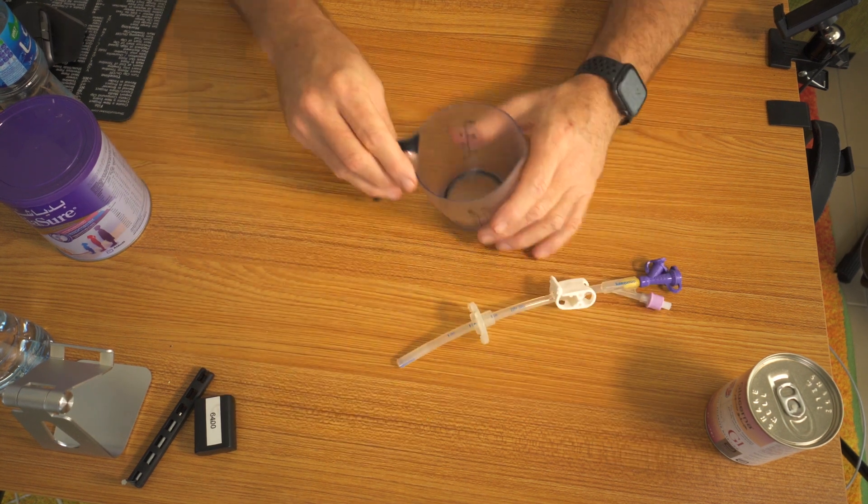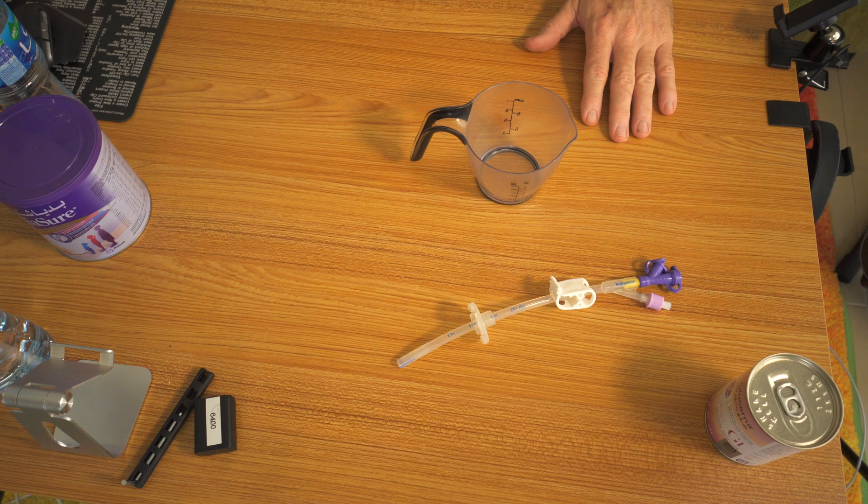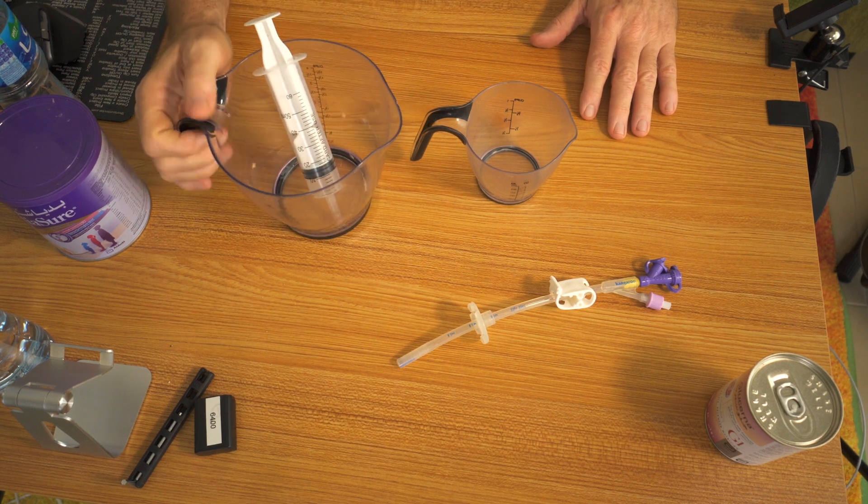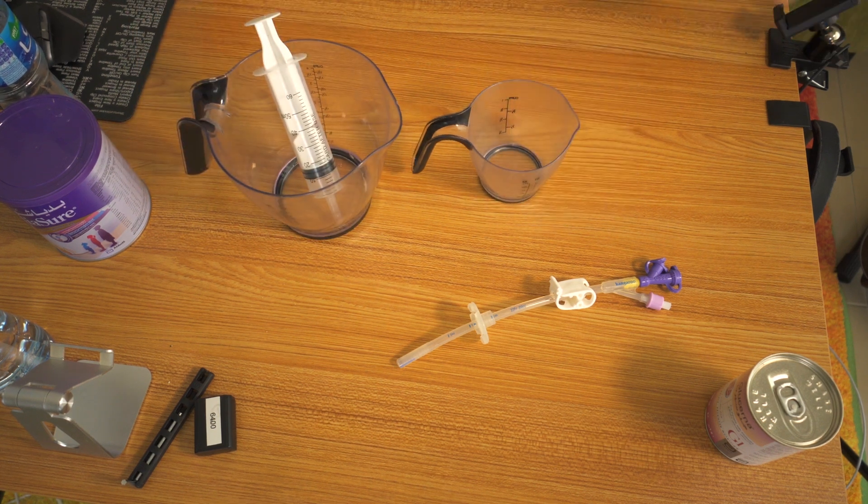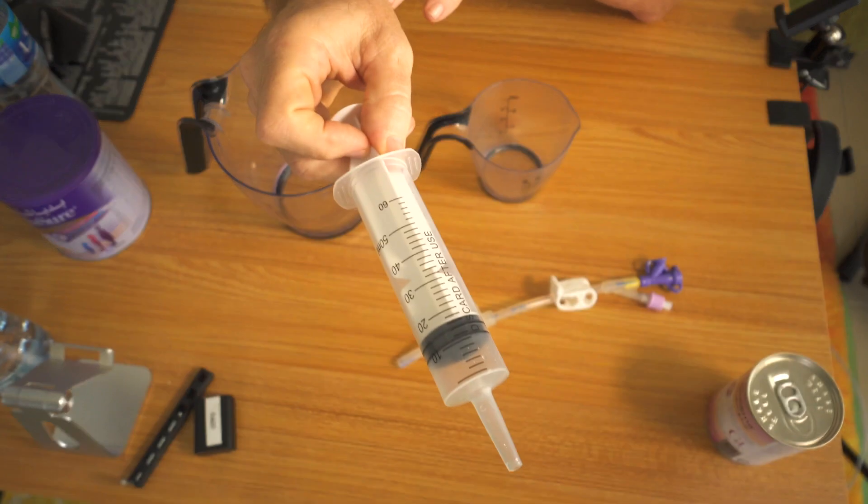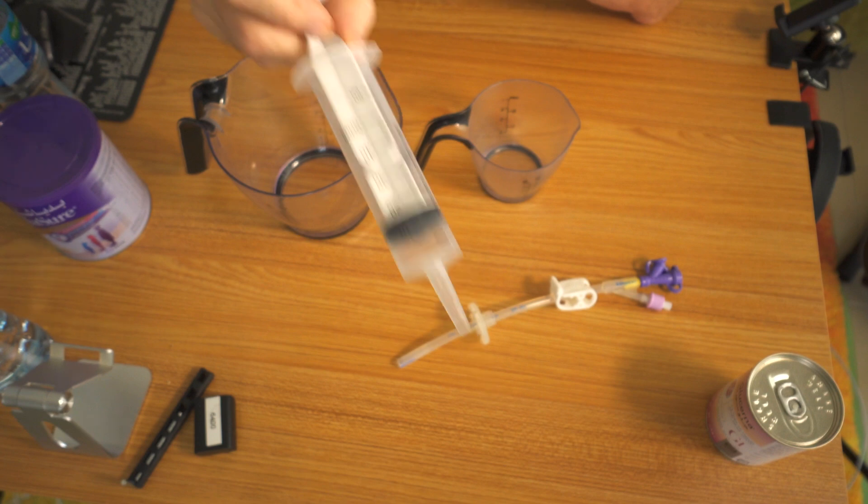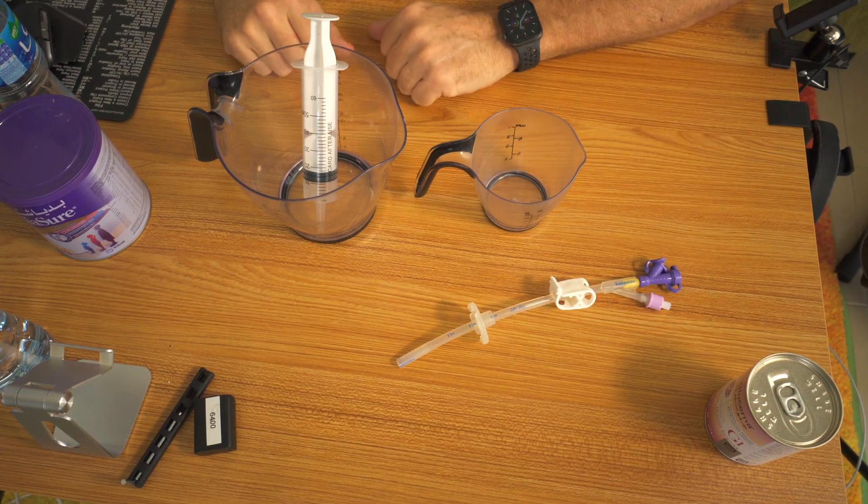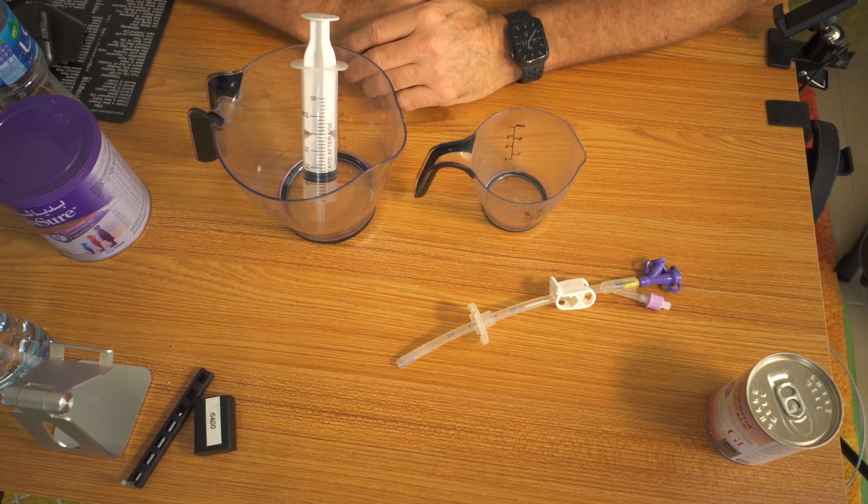Next thing you want to do is have a couple of mixing cups, a big one and a little one, and your syringe, which is how you get your food into the tube. So got all my stuff together, now let's get going.